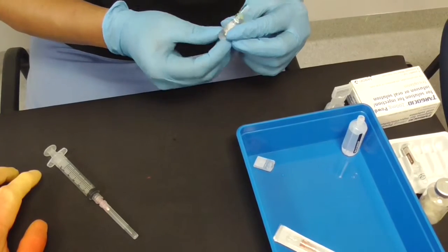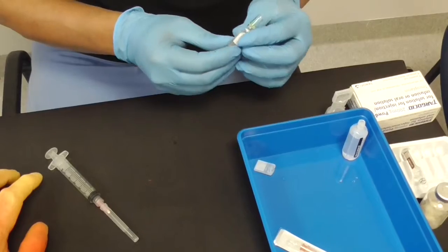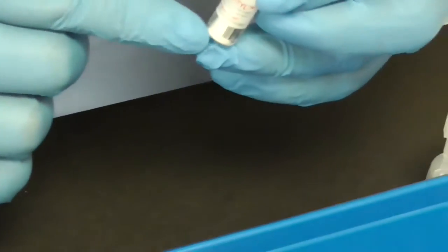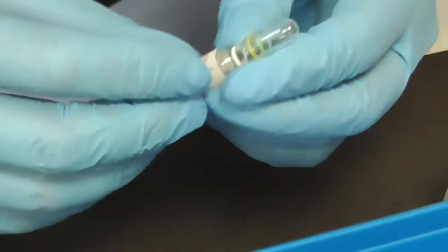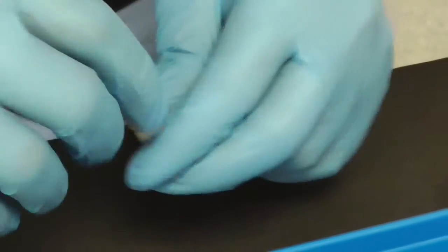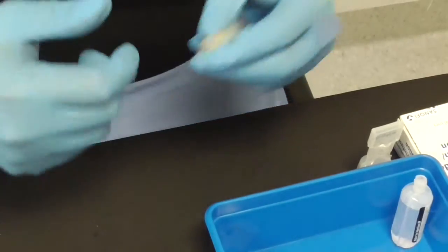Sometimes you have things like this. This is a bit of Adcortyl, and you can see there's a bit of solid stuff inside there, solid white thing inside the fluid. Before you take it, you've got to swirl it around a bit, make sure that you dissolve it. Swirling around like this will dissolve it before you draw it up.